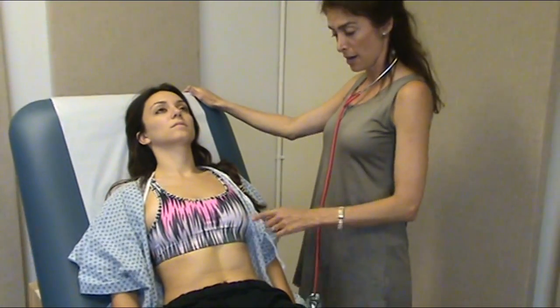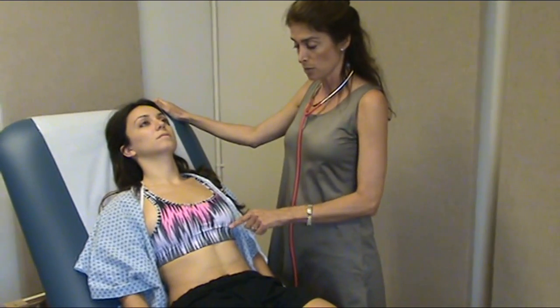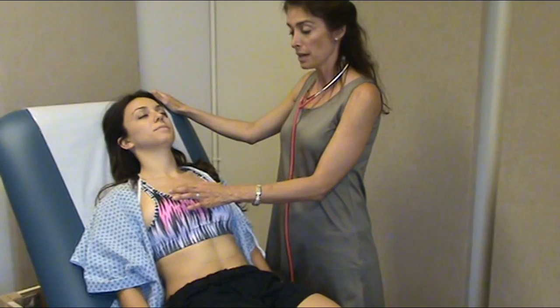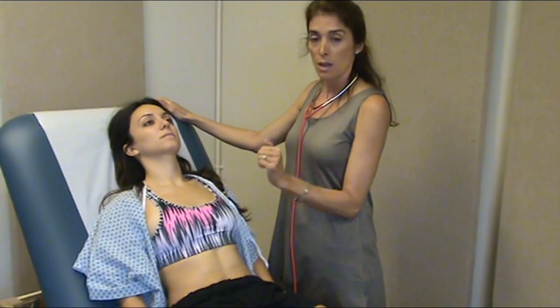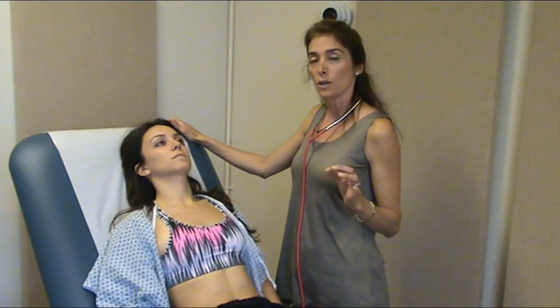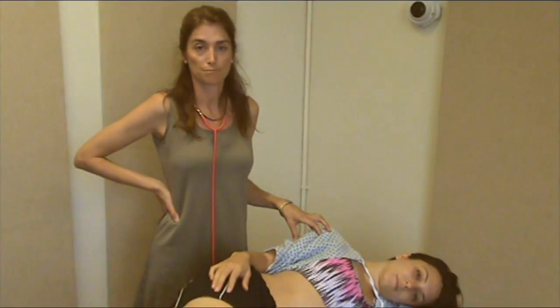S1 is going to be louder in the apex of the heart, which is the mitral and the tricuspid, and then S2 is going to be louder at the base of the heart, which corresponds to the aortic and pulmonic. If you ask the patient to take a deep breath, you can sometimes get a better split on the S2. When moving forward with the advanced cardiac exam, make sure to ask your patient to lie on their left side when you're auscultating for abnormal heart sounds, including S3 and S4.